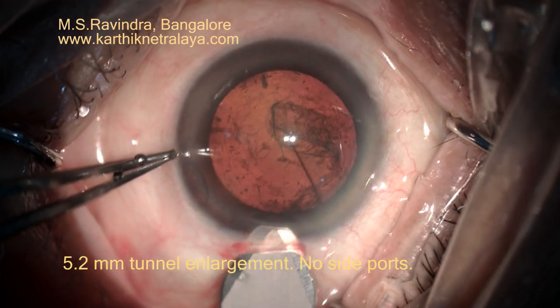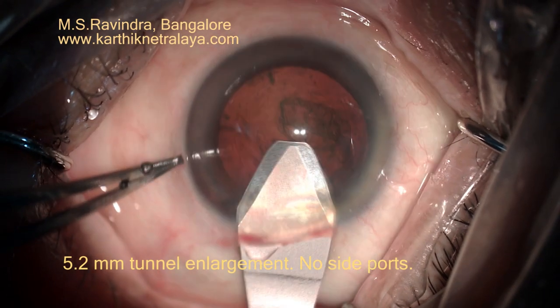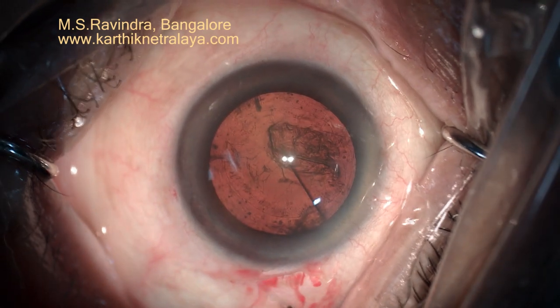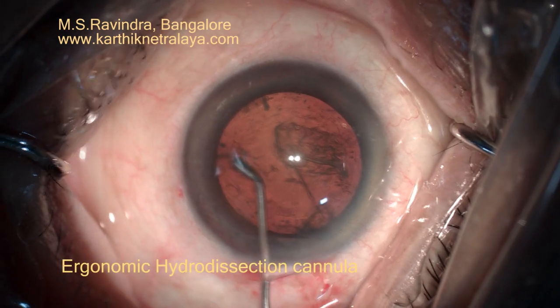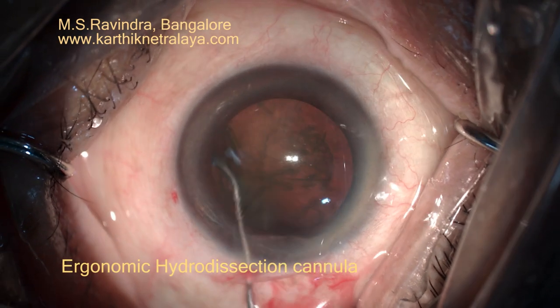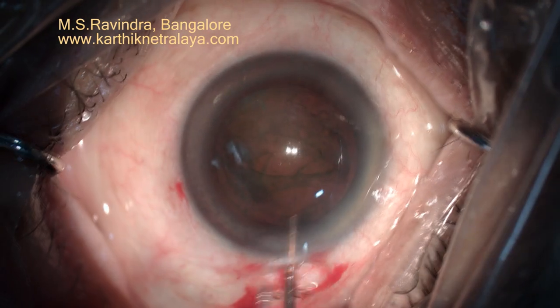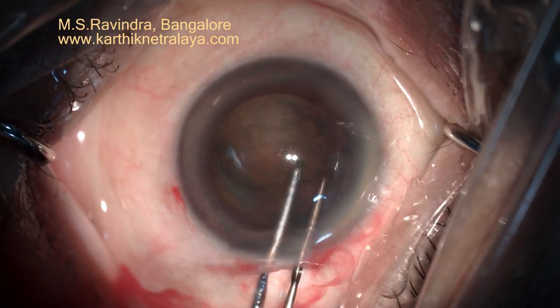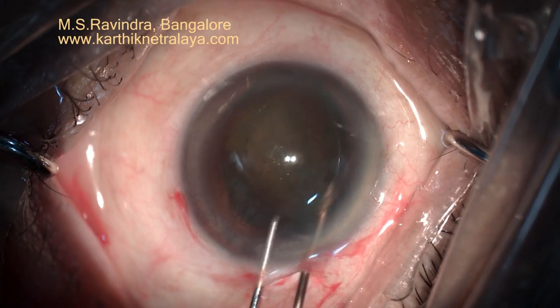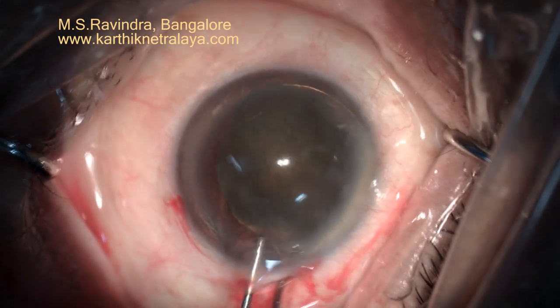The tunnel is enlarged to 5.2 mm. Note that there is a frill of conjunctiva present at the proximal end of the tunnel. This is a modified hydrodissection cannula of 27 gauge which makes the hydrodissection extremely ergonomic. The nucleus is rotated along with the epinucleus into the anterior chamber by cartwheeling.